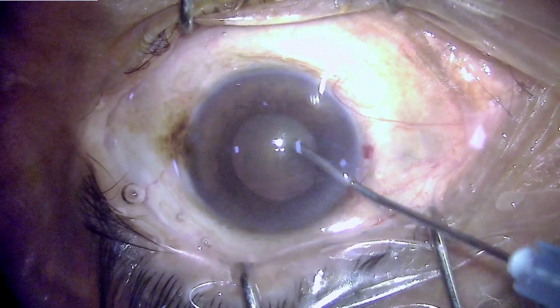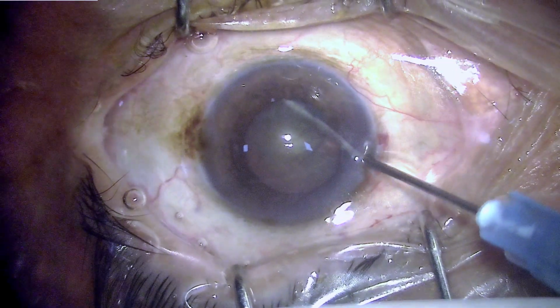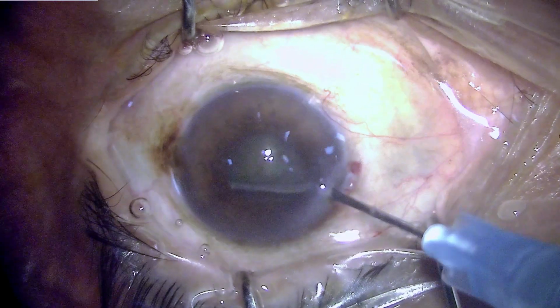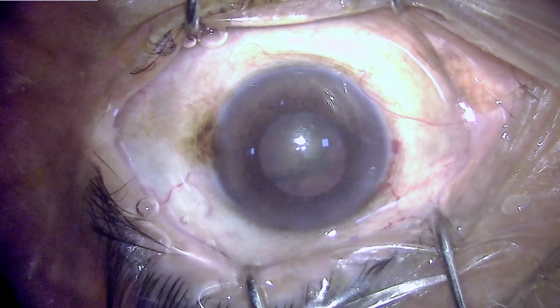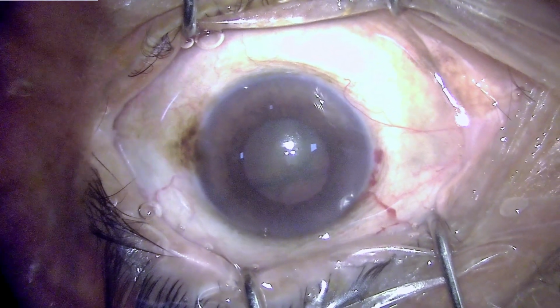Actually, I am sharing these unedited videos just to show what goes on during the surgery, and every small or large nuance is captured in the video and shared alike without compromising any portion of the video.